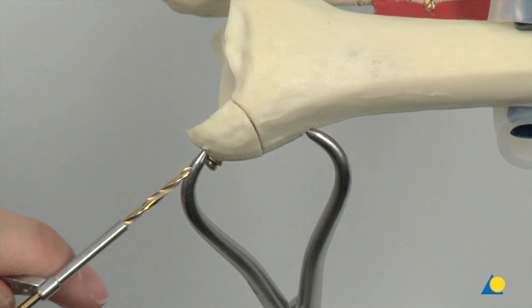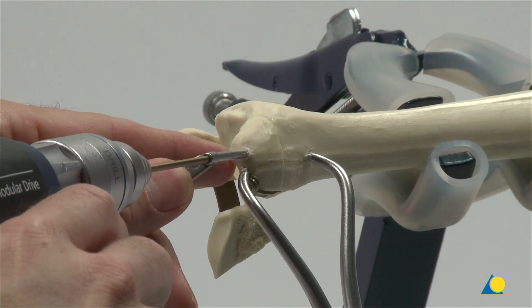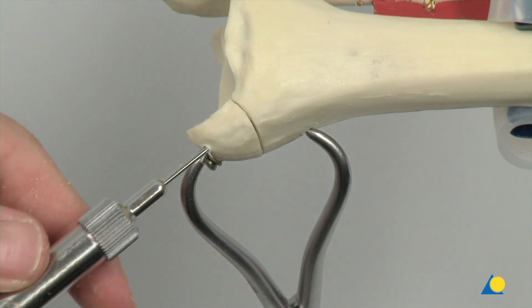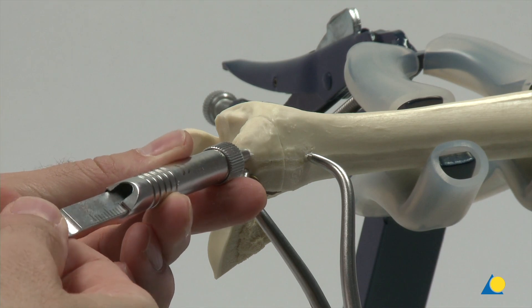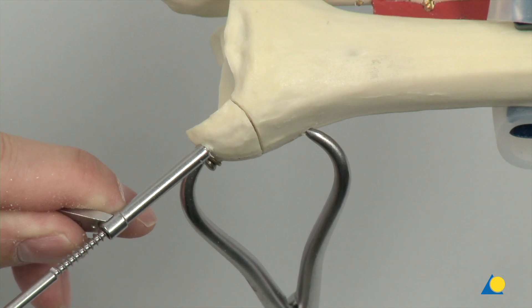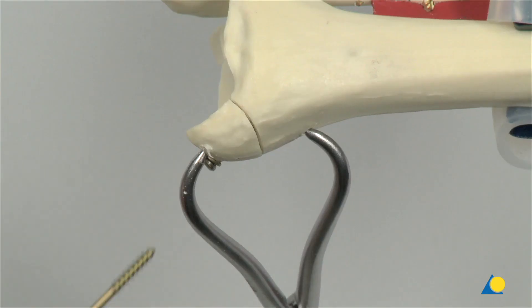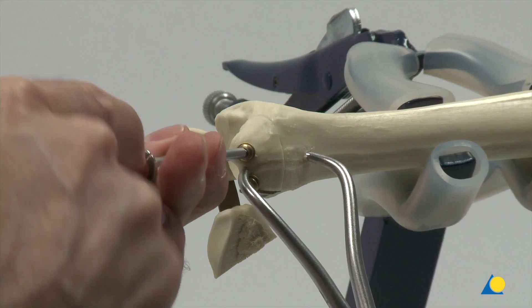The hole for the second screw is drilled with the 2.5 mm drill bit in the same position as the channel of the previously removed K wire. The required length of the screw is measured with the depth gauge. The 4.0 mm cancellous tap with appropriate sleeve is used to create the threads. The second 4.0 mm cancellous screw is inserted in the same manner as the first one.